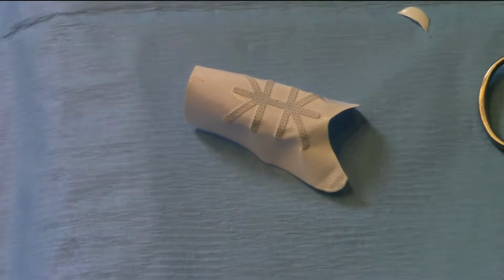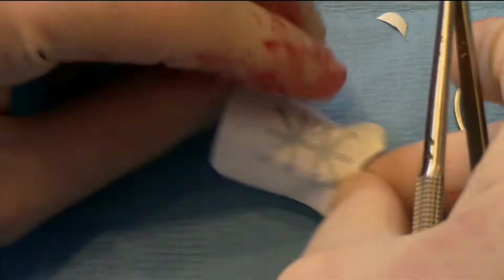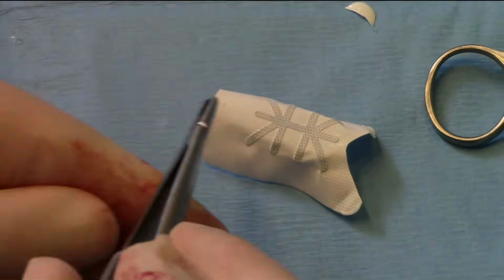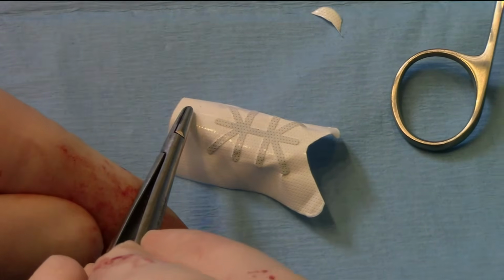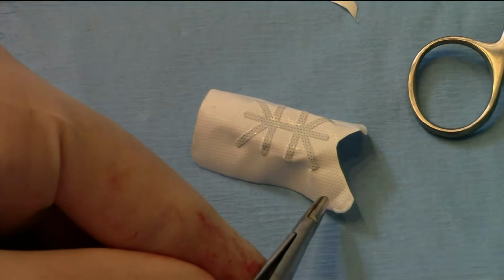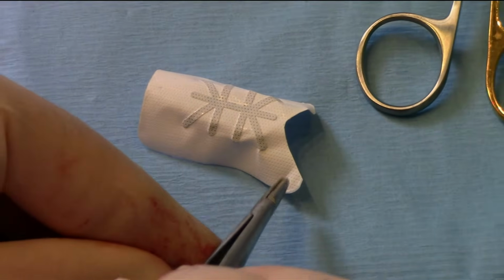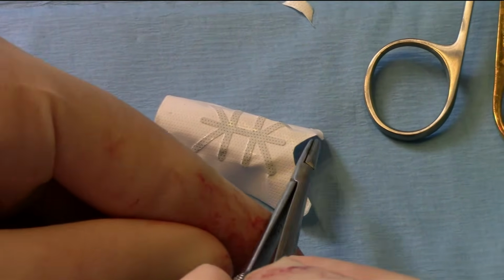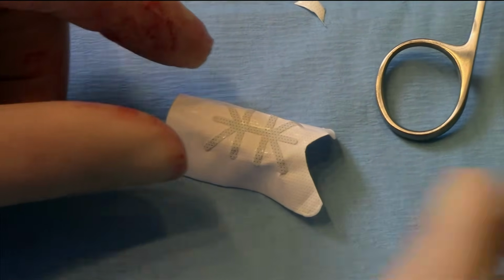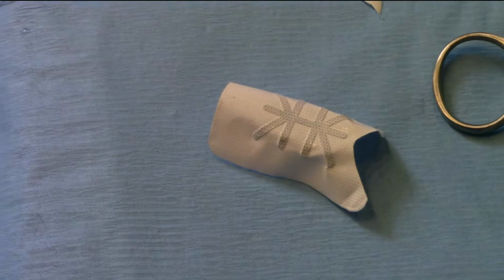So you can see I left the posterior completely intact, so we can possibly move a little tack or screw here to move it down to the bone like this. This will be to the anterior, somewhere between the canine and the premolar. This will go around the tooth and lingually to stabilize. Okay, so we're done with that.